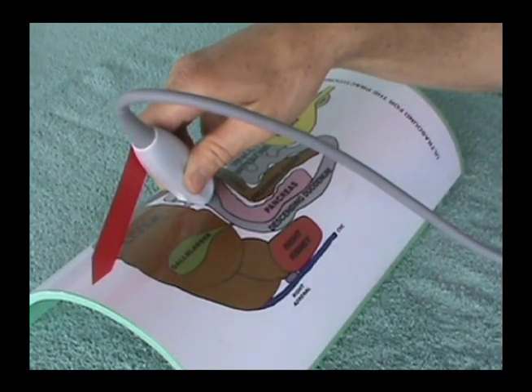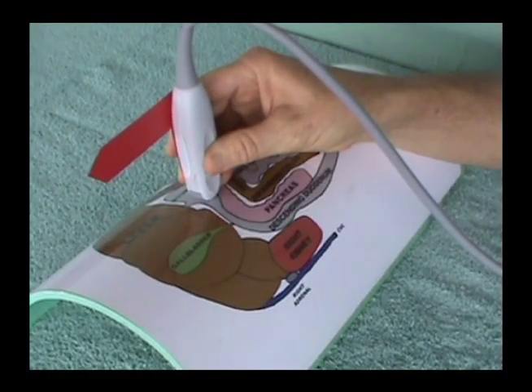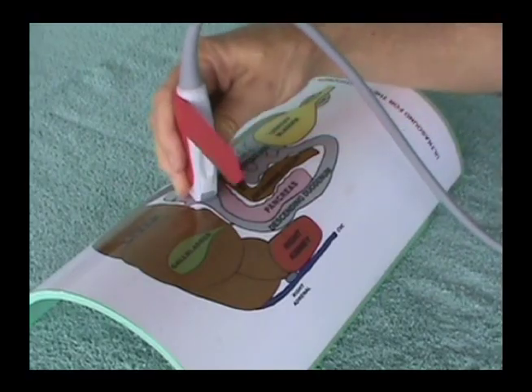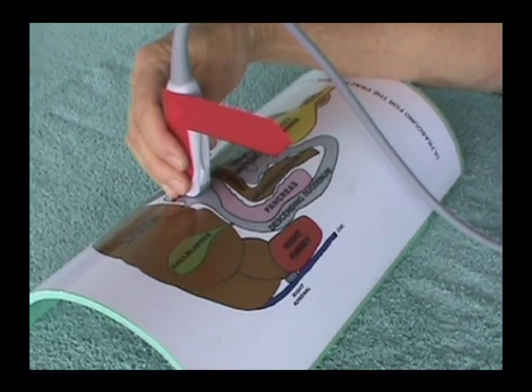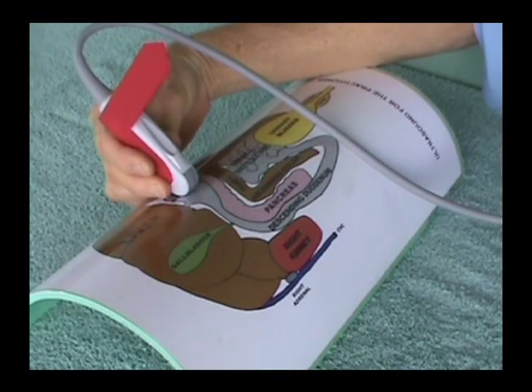Return the transducer to a perpendicular sagittal position over the stomach and rotate counterclockwise to the transverse position. From here, you can angle to the patient's right or angle to the patient's left.